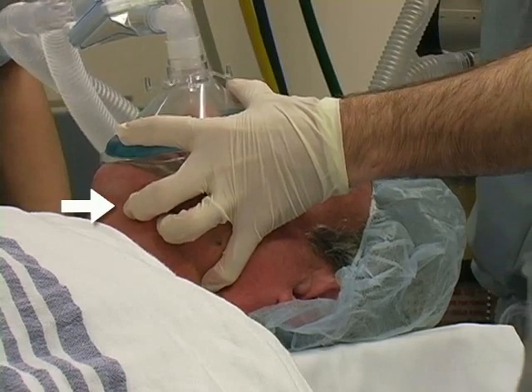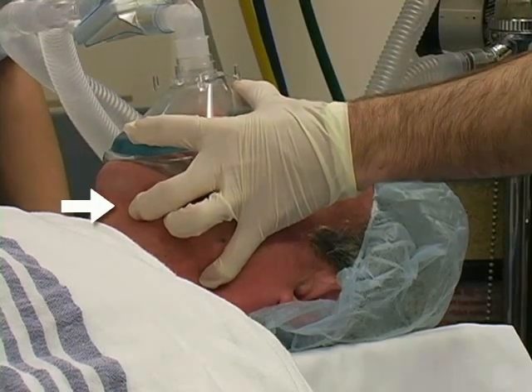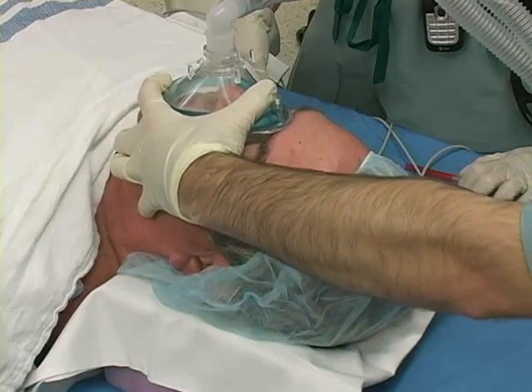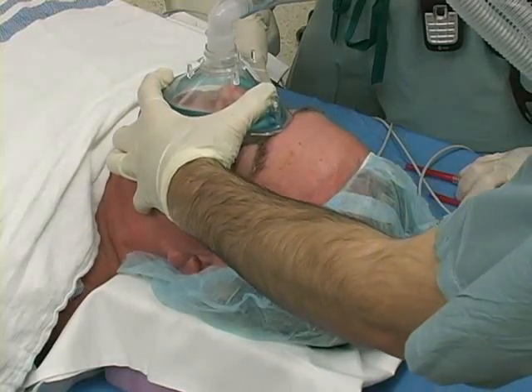Position the middle finger under the mental prominence of the jaw to bring the jaw upward into the mask using only gentle pressure. With your hand properly positioned, you will maintain correct mask placement and free the opposite hand to apply pressure to the oxygen reservoir bag.